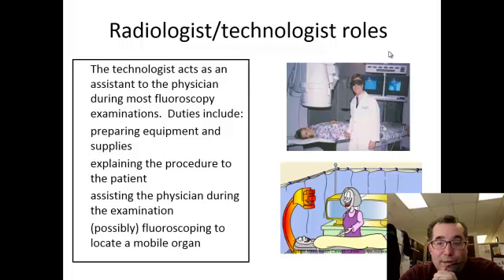And that there is no fecal matter that would interrupt the flow of barium and possibly obscure pathology. In that case, after viewing that image, a radiologist would determine whether the exam could continue or not and need to be rescheduled.